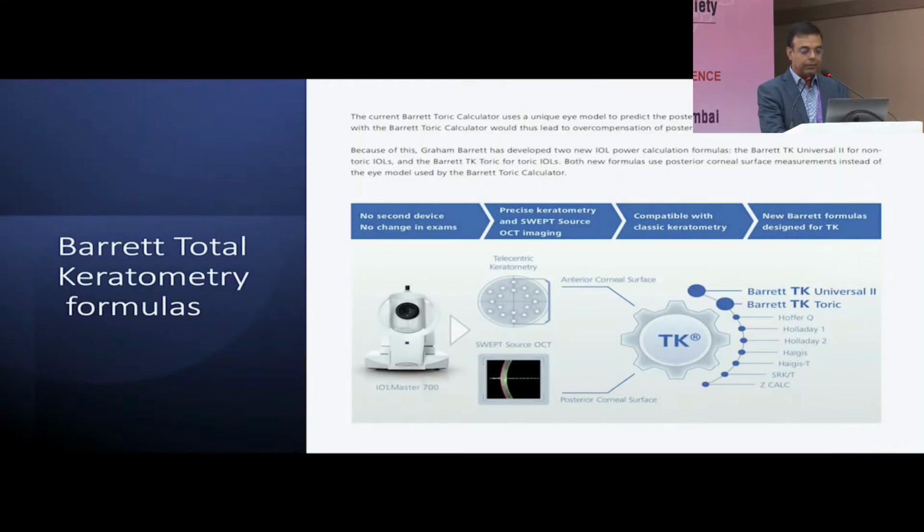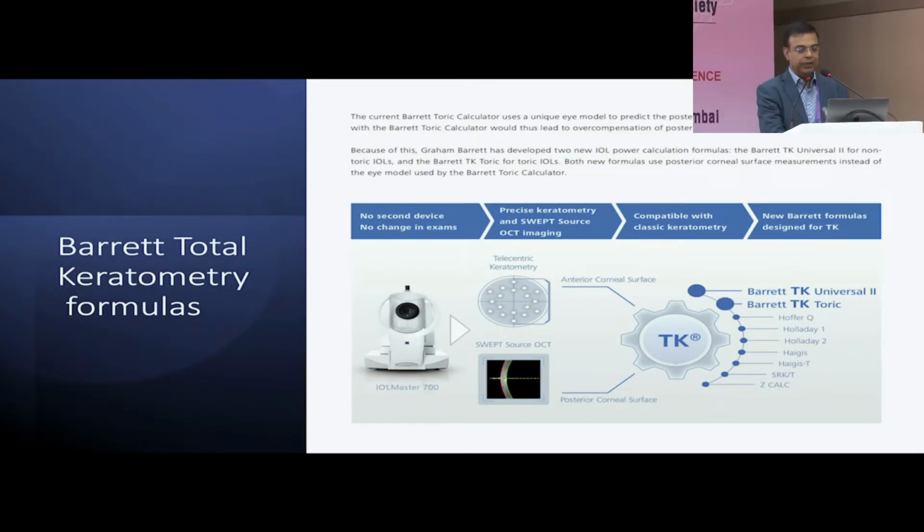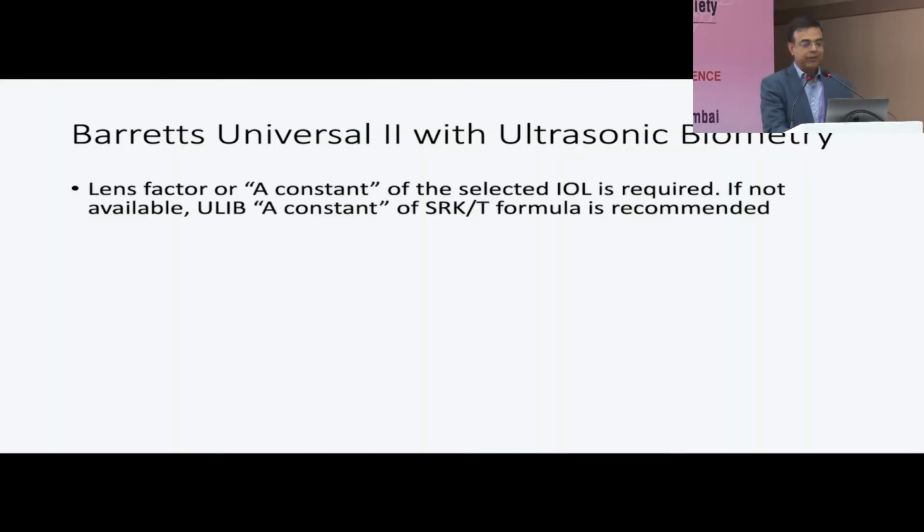So this is something which I really trust now. And of course, now coming to the total K, I think Shreyas spoke on this, but it is integrated into the IOLMaster 700, and it can be used mostly for post-refractive surgery eyes. There has been mixed opinion about how good it is. Some people find it amazingly useful, and others feel that it doesn't add so much to the values, but maybe we can have that more in the discussion, Ganesh, on this. You have more experience. I don't use it, so yeah.